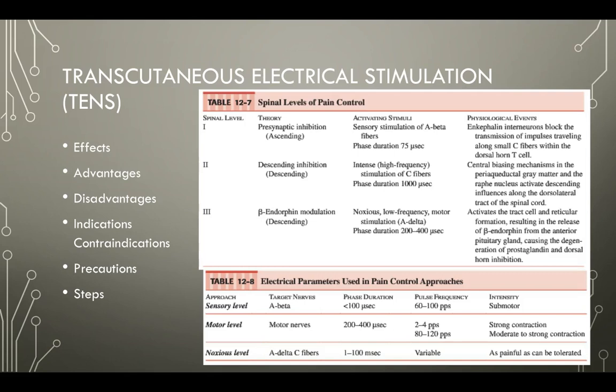So our indications are going to be pain. Mainly pain, either acute, subacute, or chronic, and the different levels that we talk about are going to be the different areas to be able to target.